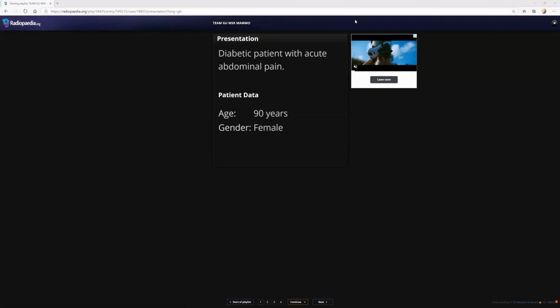The only question is whether we can get mouse control, or the examiner is doing that scrolling. Actually, I think let us try with Dr. Saneej. I think there is some problem on my settings end. Yeah, this is my first time, so I don't know the system. So I can give you remote control also. No, it's okay. If I'm comfortable with you scrolling, it's okay. Okay, whatever. In the real exam, you have to scroll. I can give you the remote control if needed. Yeah, Sahar, okay, I'll give you.